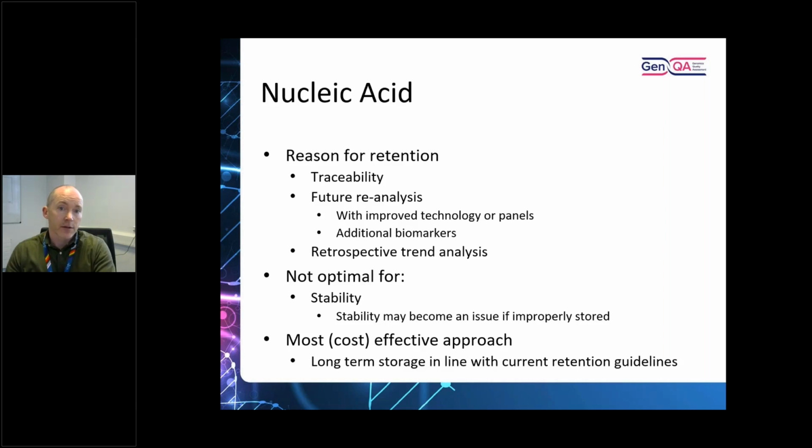So for nucleic acid, even though it's not data, it contains the potential to generate a lot of data. You might store that, and again, we're thinking about wet lab situations here, for traceability, future reanalysis, retrospective trend analysis, lots of different things you could do with nucleic acid. And I suppose by guideline, we'd keep that for quite a long time anyway.